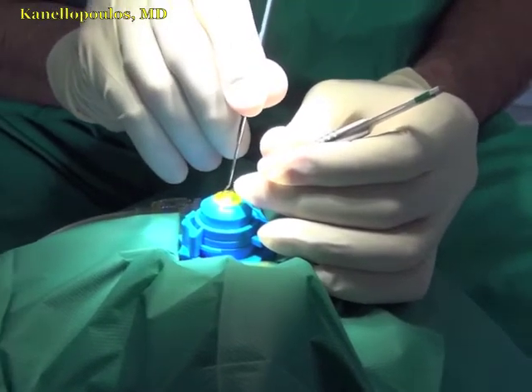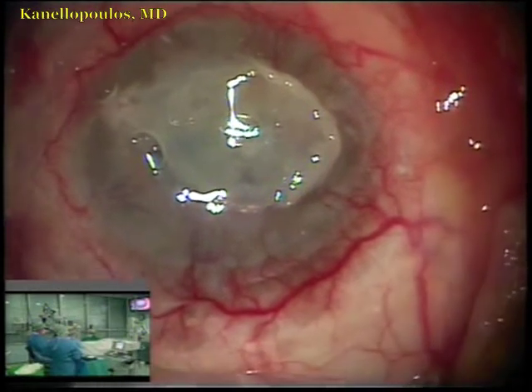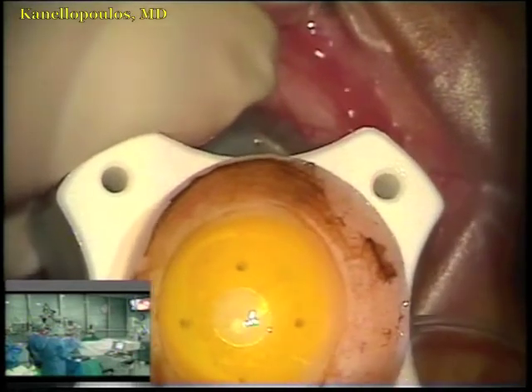As I will show you, this is a very severe patient whom we glued a week ago for cornea perforation. She has significant anterior segment disease. Here you're seeing the vehicle donor cornea with the keratoprosthesis that we've worked on before.